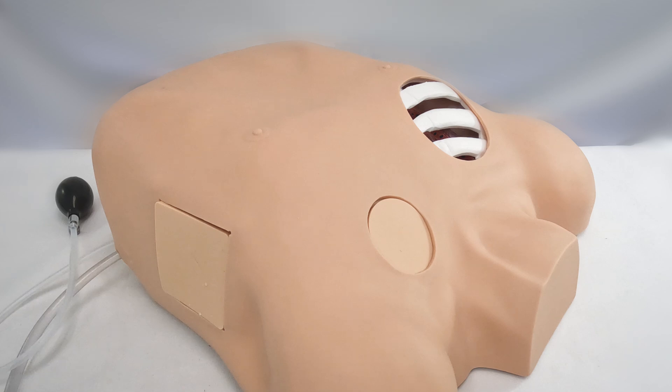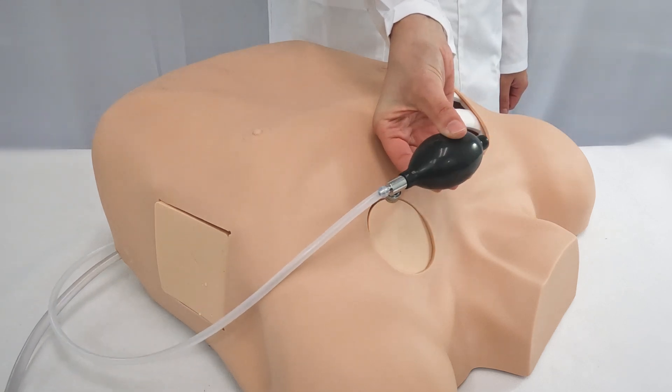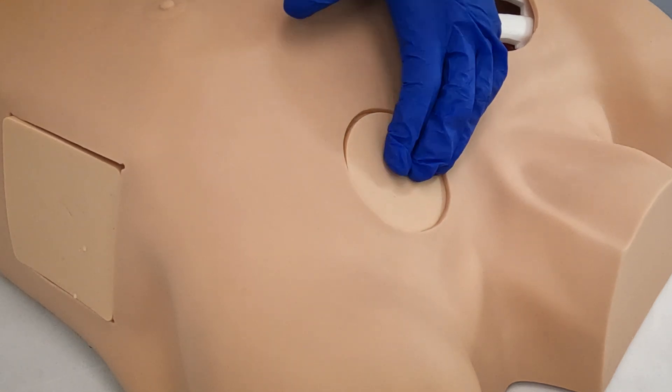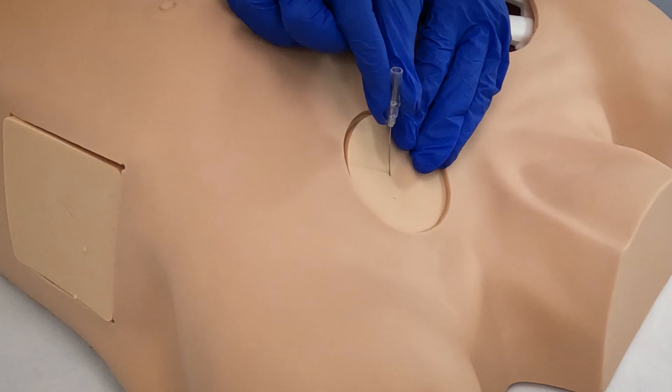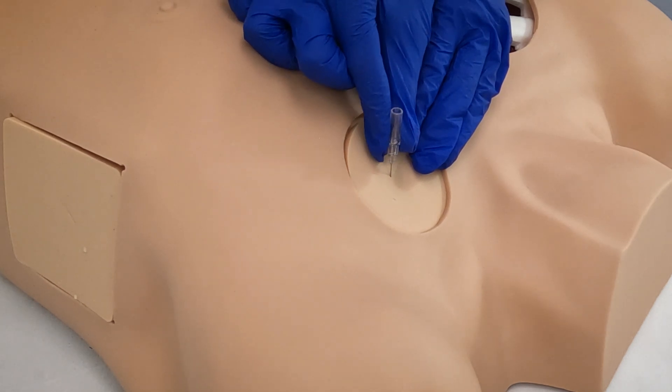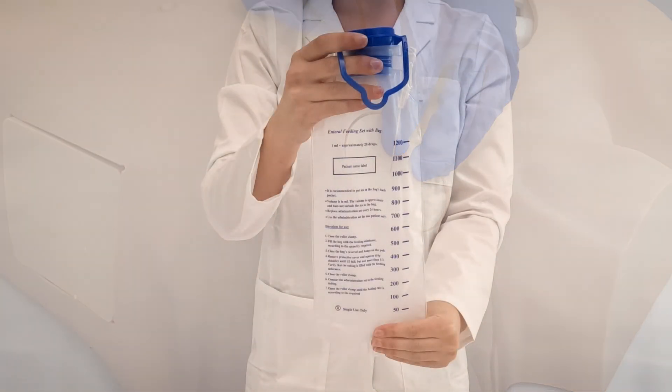To simulate needle decompression, fill the simulated lungs with air using the included inflation bulb. There will be a realistic release of air on insertion of the needle into the replaceable simulated skin over the second intercostal space in the mid-clavicular line.